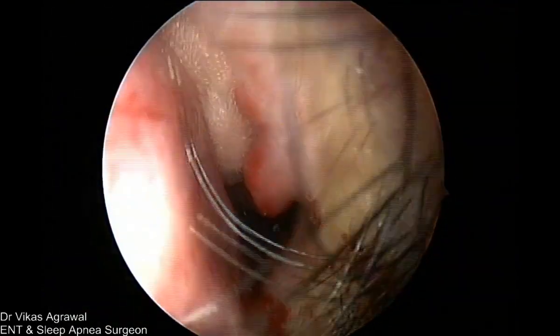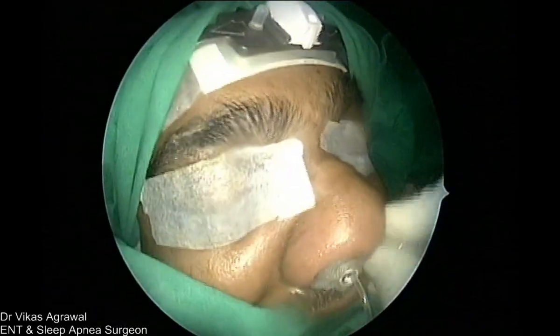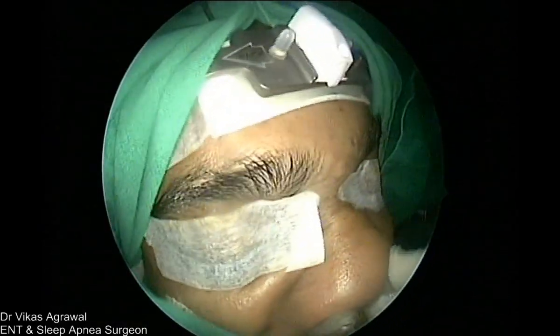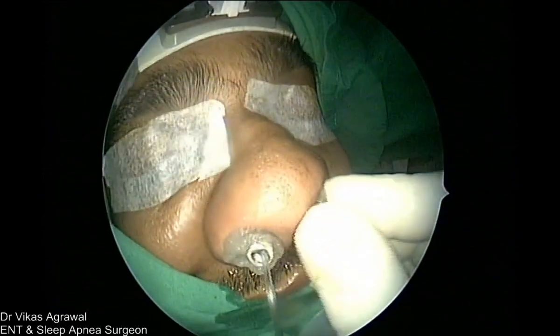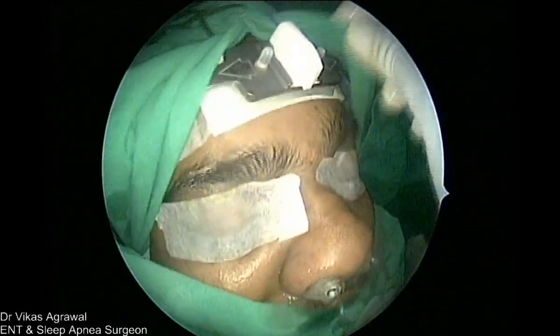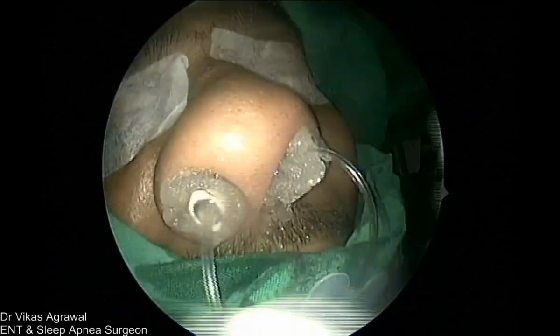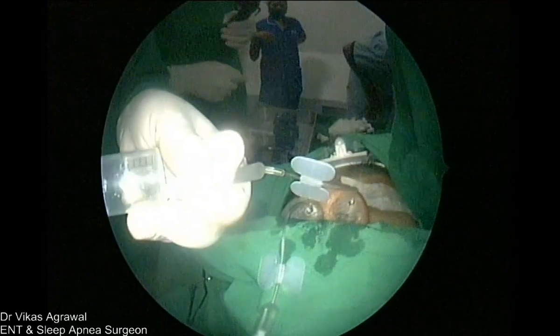Give me the other one, the other pack. So, and then we can just inflate. Okay, inflate. Now show this, show it while inflating. You go to the external camera now. Yes, external camera. Show it here.